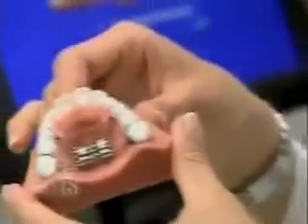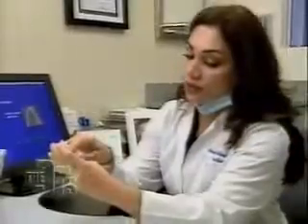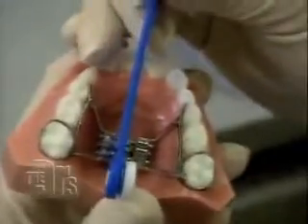This is the shape of the expander that goes to the upper jaw. Okay. There is a screw here. And where does the key go? The key goes right in the middle. You have to turn it. Then we check up on you on a weekly basis and make sure you know how to do it and you get it right. You ready?